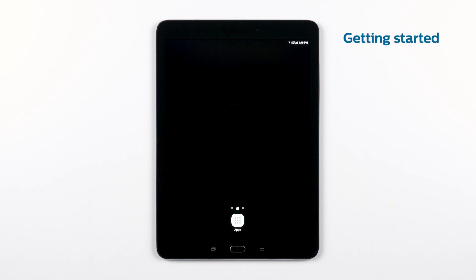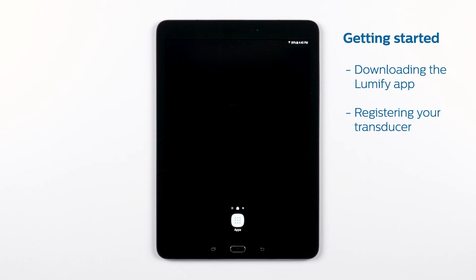Getting started with Philips Lumify. In this video, we'll go over downloading the Philips Lumify app from the App Store, registering your transducer, and all the steps you need to get started with your Philips Lumify system.